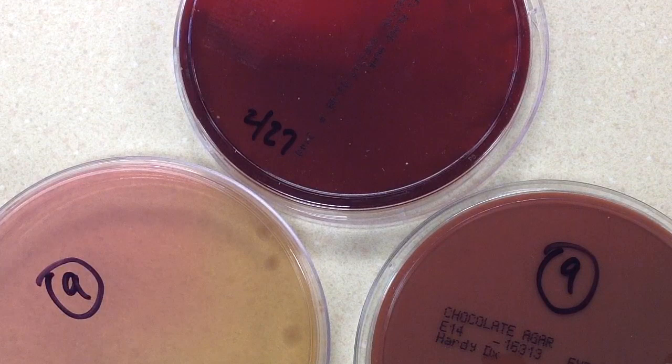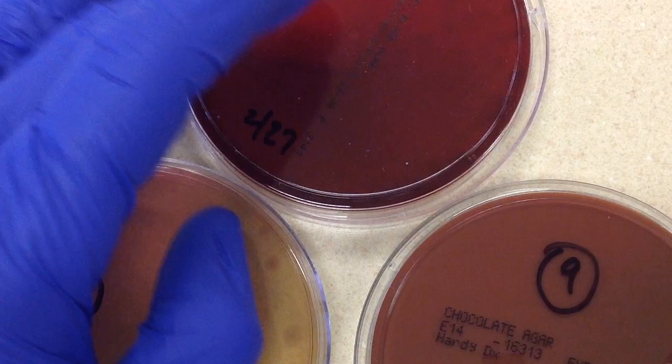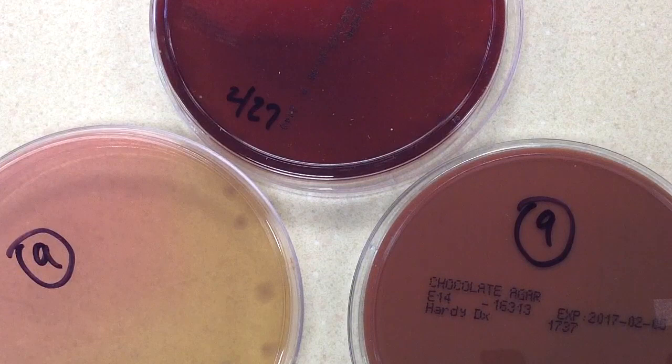This is a culture from an aerobic blood culture bottle from a patient with a ruptured appendix. The anaerobic bottle also came up positive on the instrument, but we're only working up one of them. Whenever a blood culture on an instrument comes up positive, the alarm goes off, the tech goes over, turns the alarm off, pulls the bottle or bottles, and then the first thing that person does is make a direct gram stain of that blood. That's what was done on this particular culture.